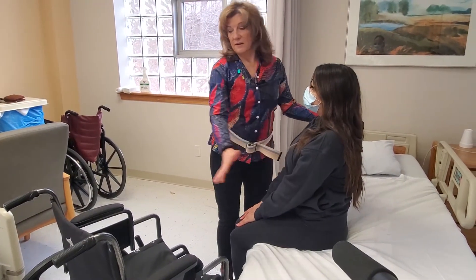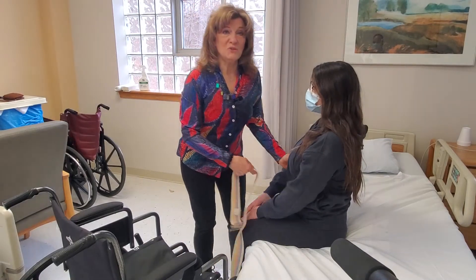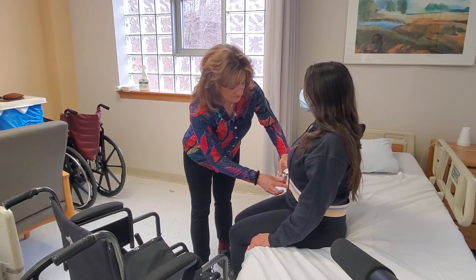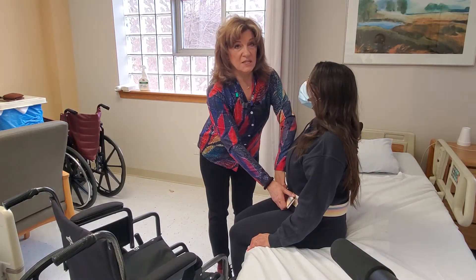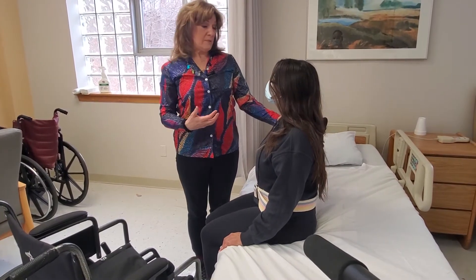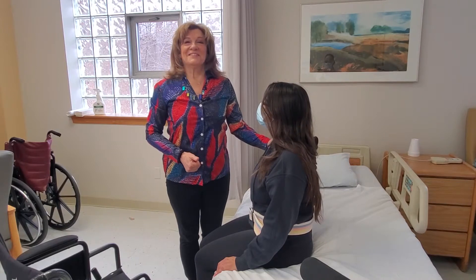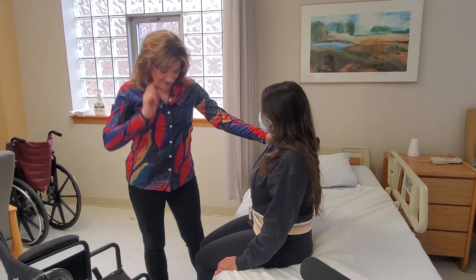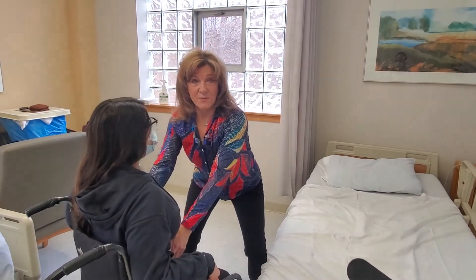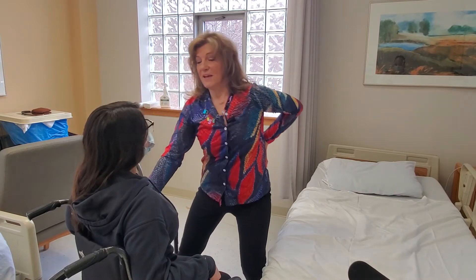Tell the person to take their strong side and reach over to the railing on the chair. But first we're going to put the grab belt on her. You can get these grab belts on Amazon and a lot of other sites — physical therapy and occupational therapy suppliers carry them. If you go see a physical therapist, they'll find the right equipment for you, and as you rehabilitate and get stronger, you can move to a cane, a walker, or something else. Now, touch your feet to the floor, I grab the belt, hold onto the chair, and pivot. Look how nice and easy that was. Make sure your knees are bent, feet straddled, back is straight — you don't want to bend over or you'll hurt your back.